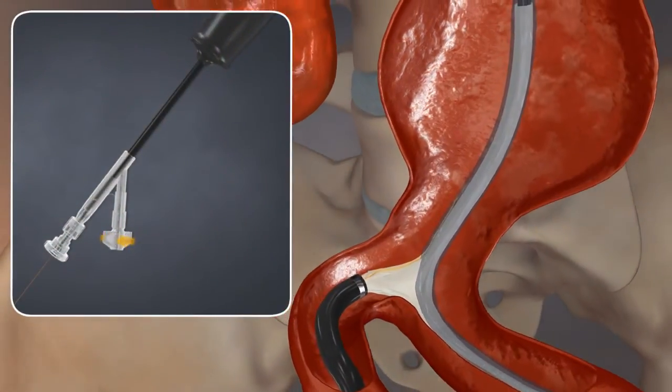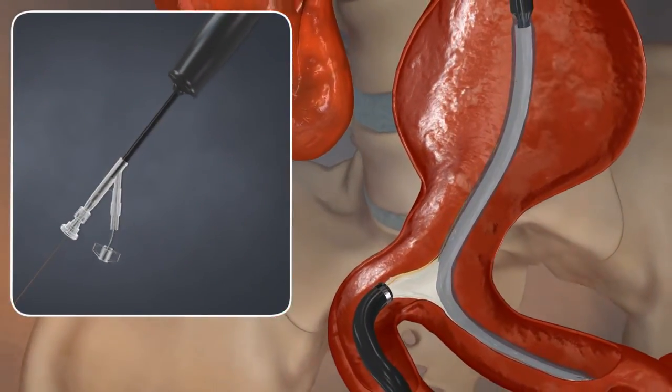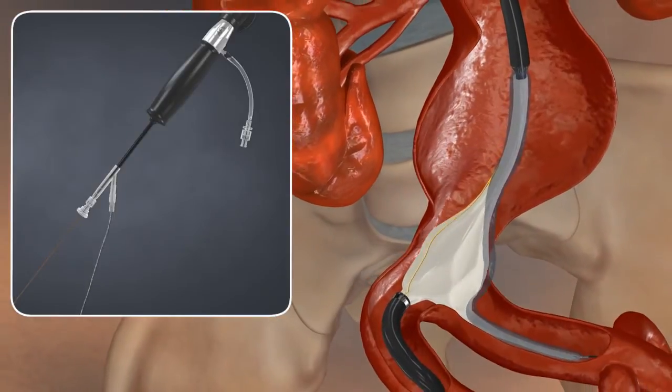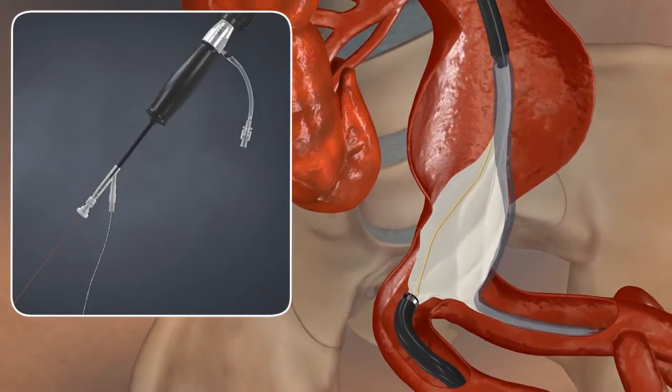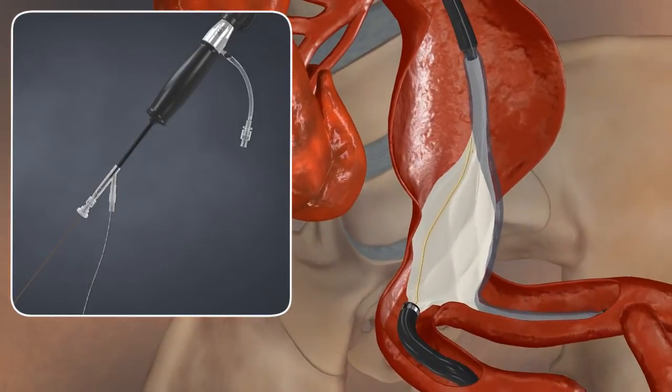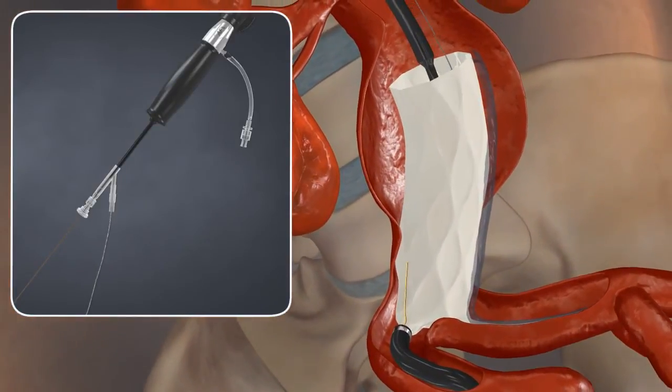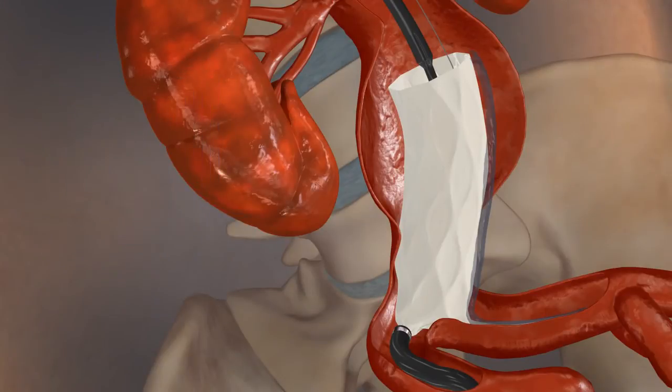To deploy the main body, twist and pull the control cord handle. If necessary, you can stop at any point to reposition the stent graft.